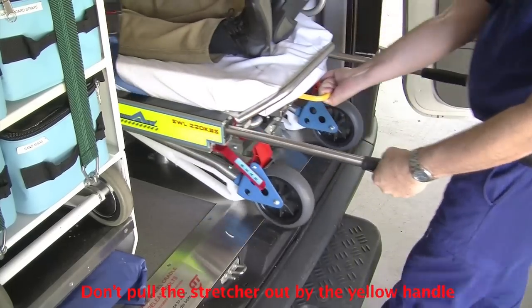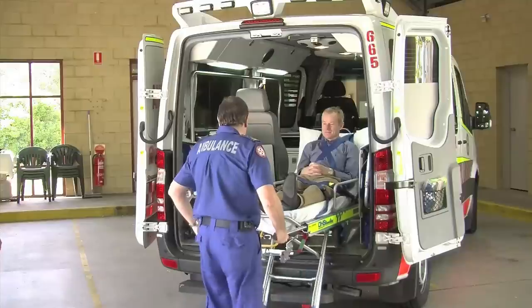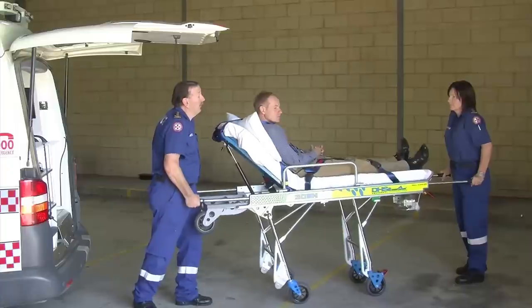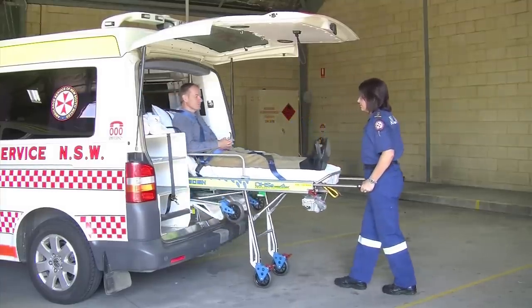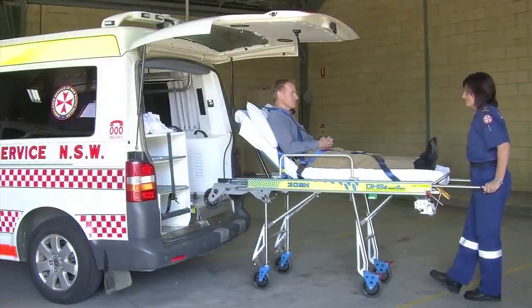Watch what happens if you use the yellow release handle to remove the stretcher. The front legs will release when the stretcher is half way out of the vehicle. Like the rear legs, they have a safety position which you will hear click as the legs fall to full height. But it's best if the front loading wheels remain in the vehicle until it's confirmed the front legs are locked.